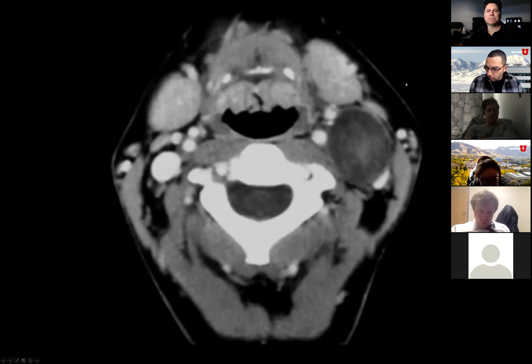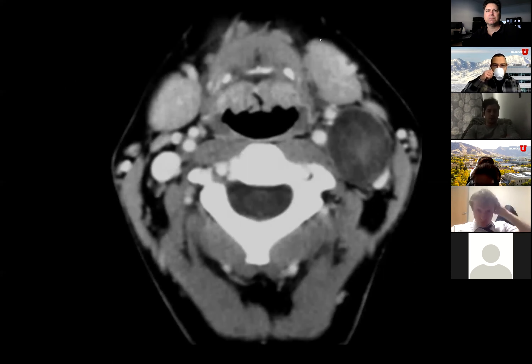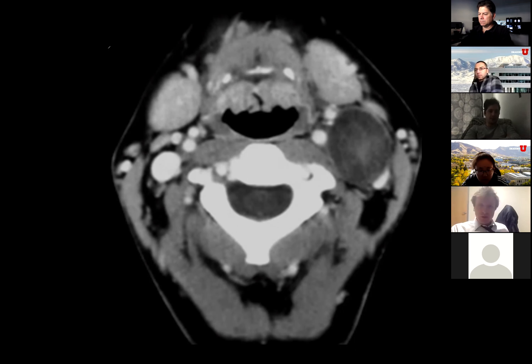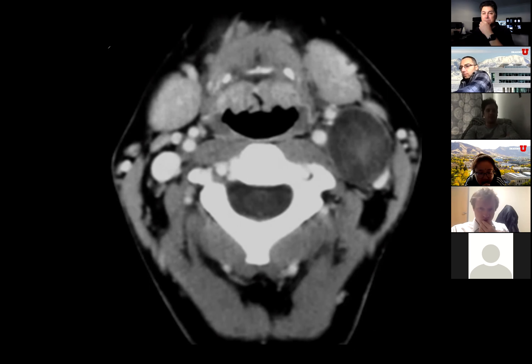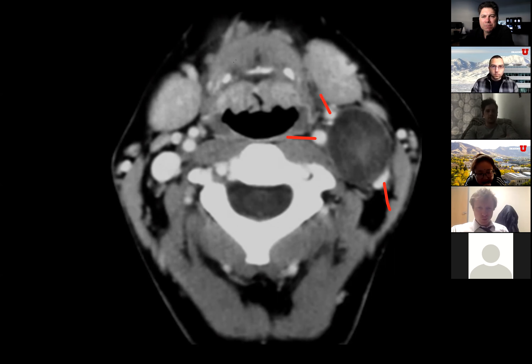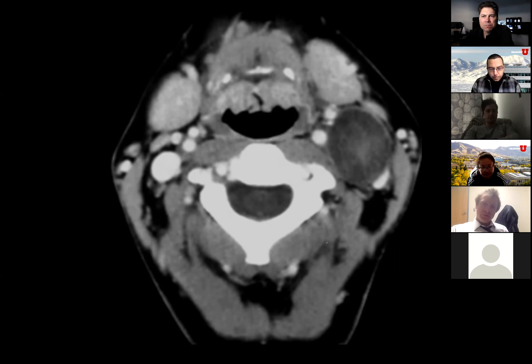Axial CT of the neck with contrast. We're looking at a very well-circumscribed hypoattenuating lesion centered about the left carotid space, in the expected location. There may be splaying of the internal and external carotids — though that could be the jugular vein. That's the jug, that's probably ICA, that's probably ECA. This is some sort of lesion centered in the carotid space on the left.